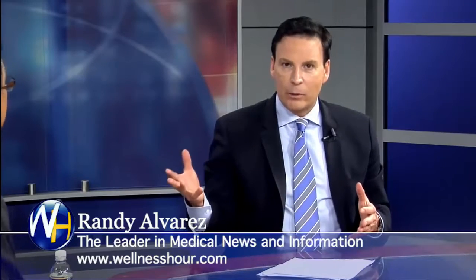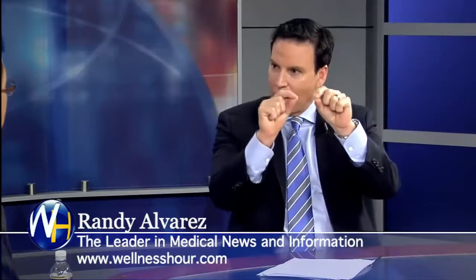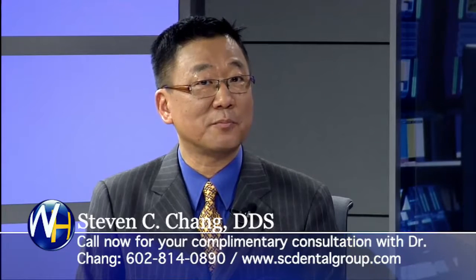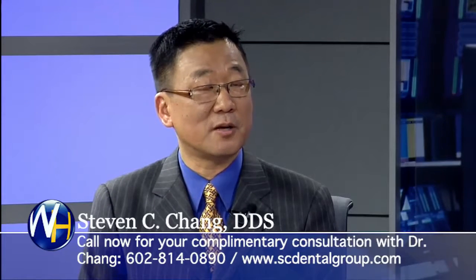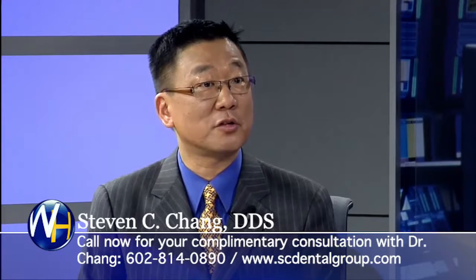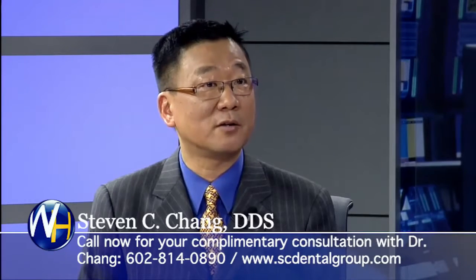If you're just tuning in, we're talking about a new treatment option that less than 1% of dentists across the country offer. Periodontists treat gum recession by transplanting tissue from the roof of the mouth onto the receded area. With this new technique, you carefully put in small pinhole needles and pull down the gums, and they stay there, very stable. It was a very clever idea, using a very small pinhole and a specially designed instrument invented for this, to bring the gum down without cutting or suturing. The pinholes we create during the surgery are almost invisible at the end, or within 24 hours. In most cases you can't even find them.